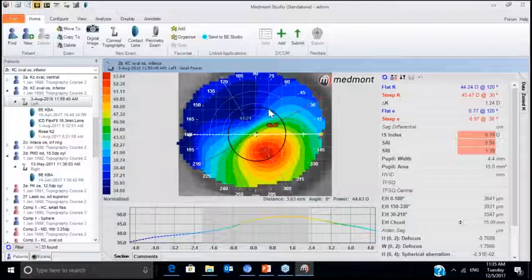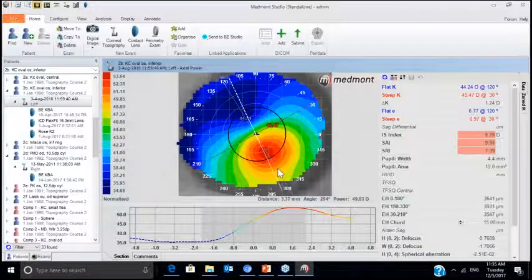Let's take another case, somebody that's slightly tougher, and put on a corneal GP on this patient. So here's a keratoconic patient. Of course, we might look at the disease detection indices here, and we see they're all lighting up in red. One of the most important ones that the surgeons rely on is the IS value. The IS index stands for inferior versus superior average curvature.